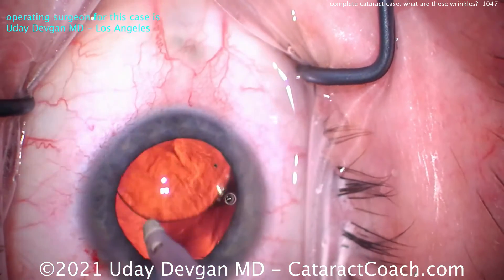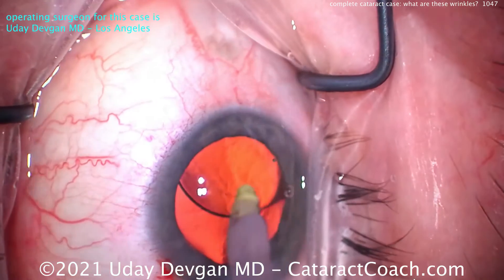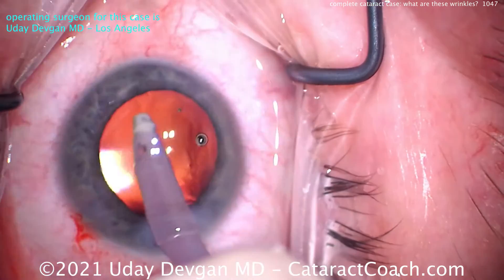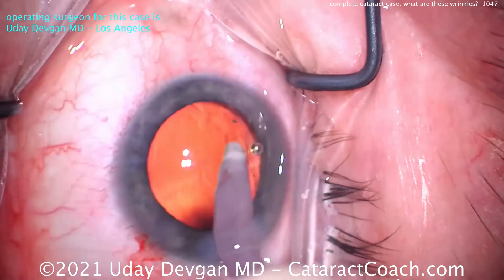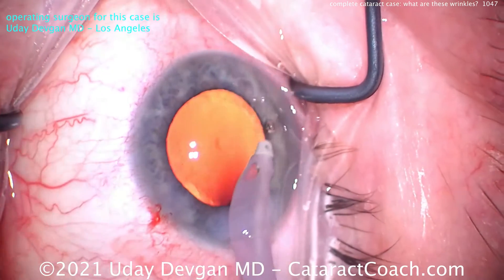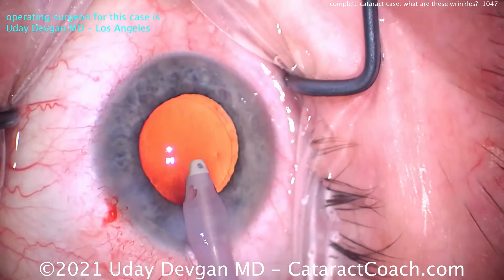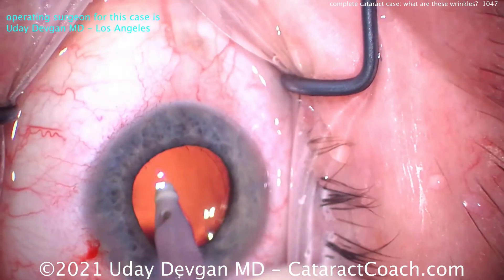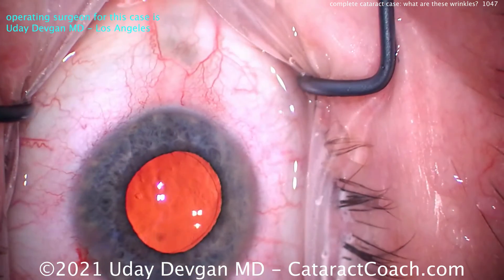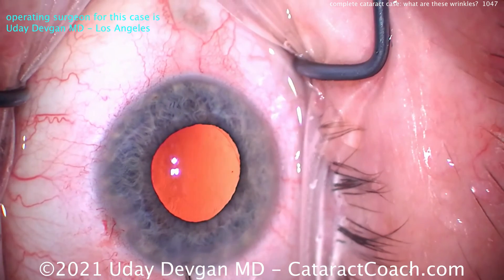Settings: we've got a lot higher flow — 50 to 60 cc per minute — also high vacuum. Get that fluid flowing through the eye to wash out all that viscoelastic from behind the optic. Remember, you want that optic posterior surface to directly touch the posterior capsule. With this lens material in particular it's slightly sticky, slightly tacky — so where you put it, it tends to stay, which is great. Taking out all our viscoelastic, making sure we've got nothing left there in the angle. That looks pretty good.